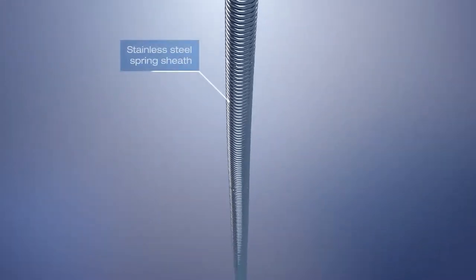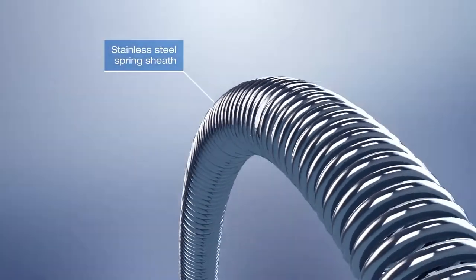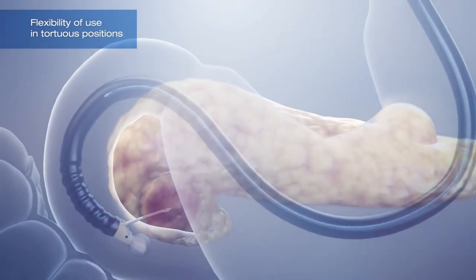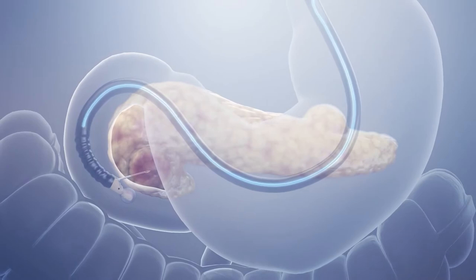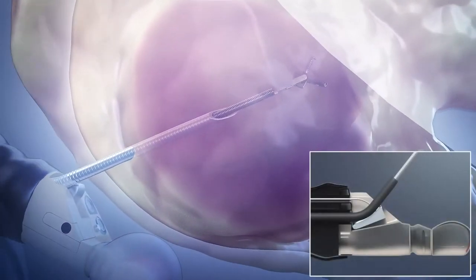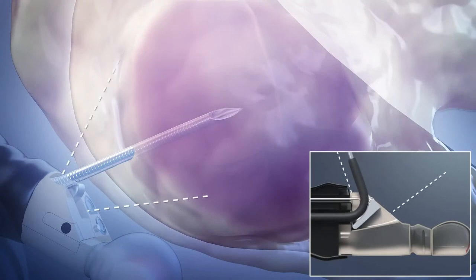The device features a stainless steel spring sheath, which allows flexibility of use in tortuous positions demanded by the procedure. The design of the forceps allows for continued usability in these conditions, permitting clinicians to sample at multiple angles using the ECHO Endoscopes elevator.